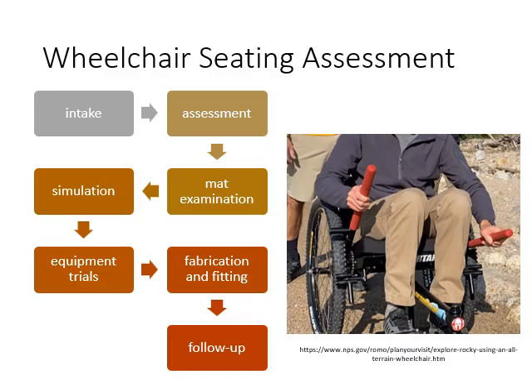The wheelchair seating assessment will follow a natural process. In the beginning, of course, the client will be interviewed, their family will be interviewed, they'll gather information, look at what they're currently using, and look at their current posture. It will be followed by an examination on an unsupported sitting surface, so a mat in the clinic. You've seen those in our gross motor labs.